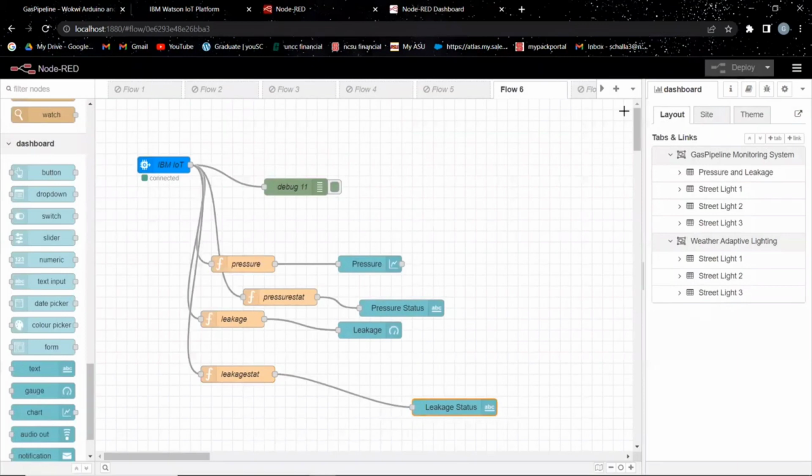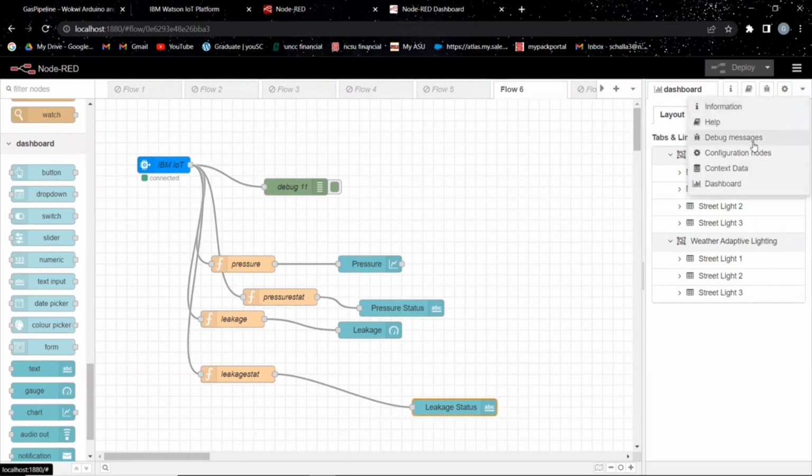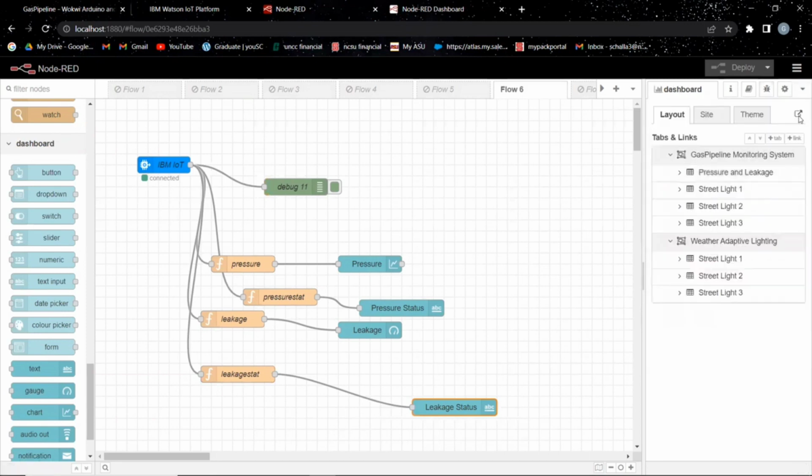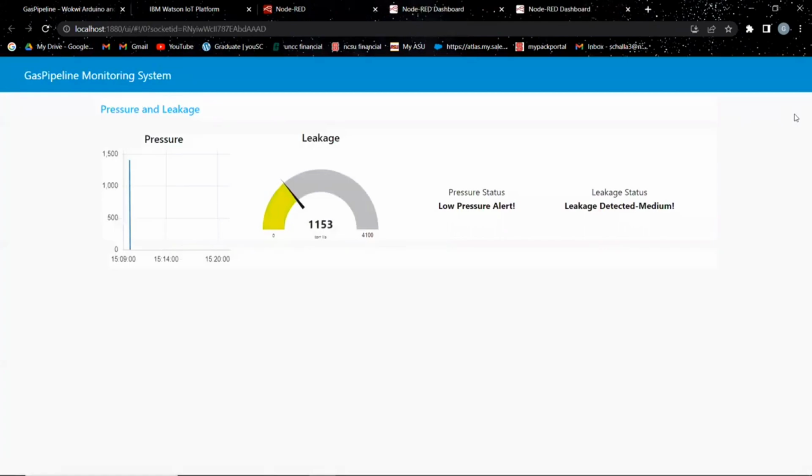So with this, your flow diagram is complete. So in order to see the debug messages, go to the top right drop-down menu and click on debug messages. As you can see, all debug messages are shown here. So in order to see the UI in a different tab, go to dashboard in the same drop-down menu. Then click on the icon that takes you to another tab.